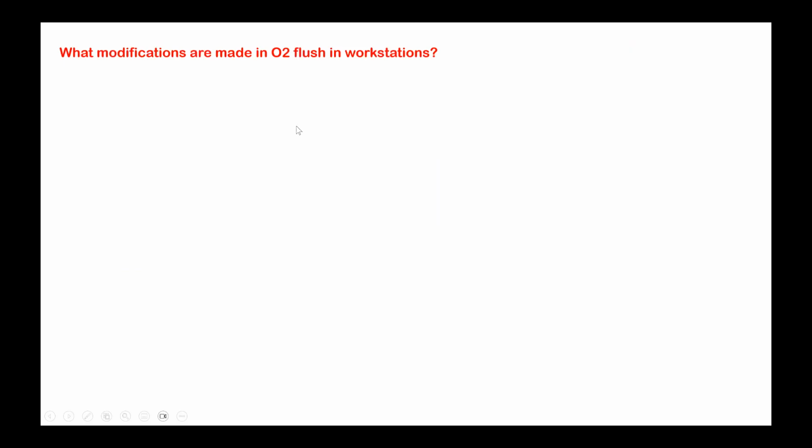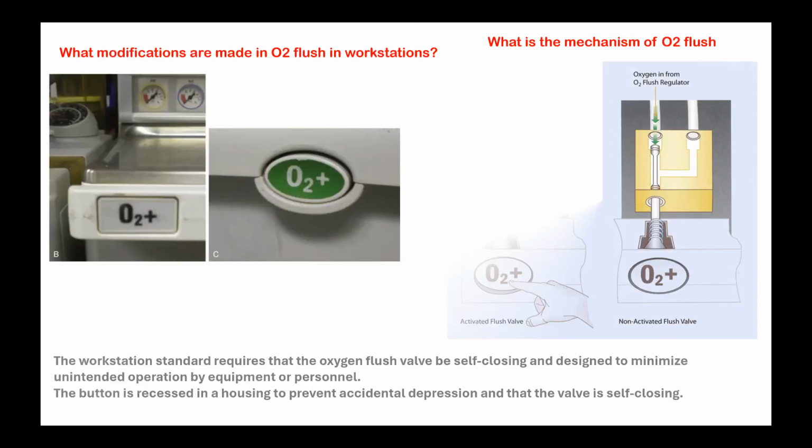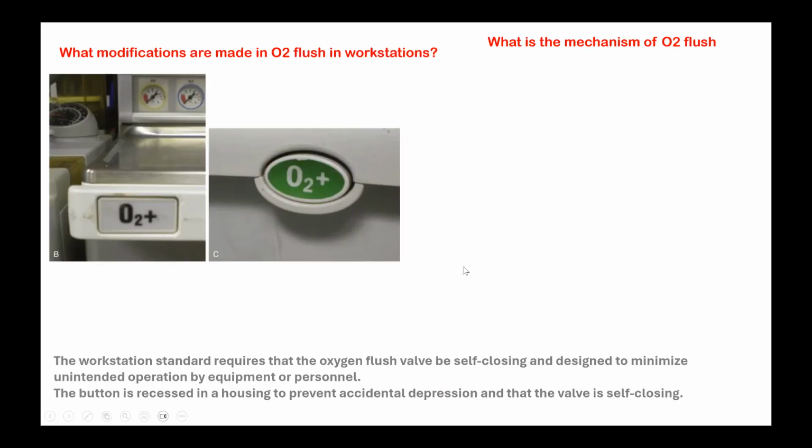What modifications are made to the oxygen flush in the workstation? Already we have seen that being done. This is the same question. What is the mechanism of working of that oxygen flush? So when you push this button, what happens?